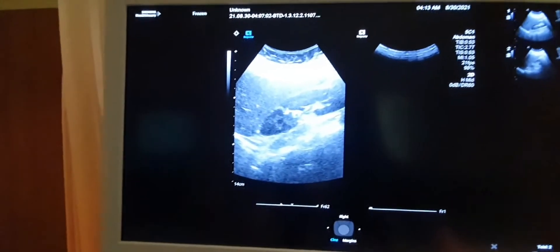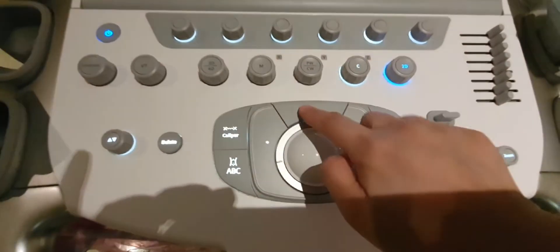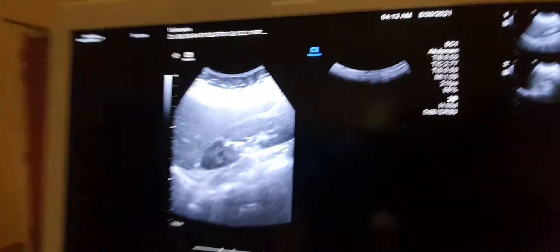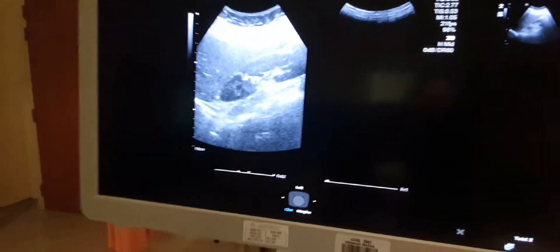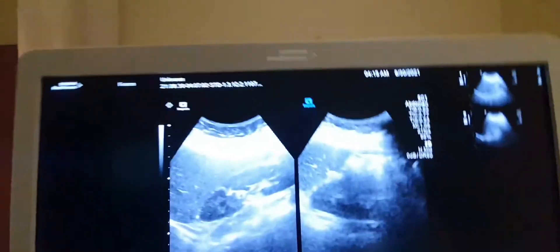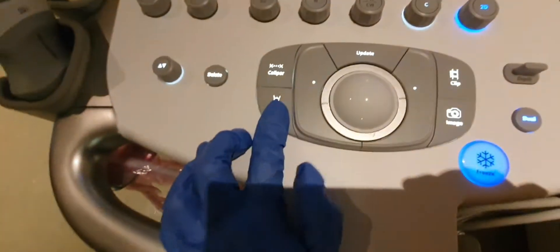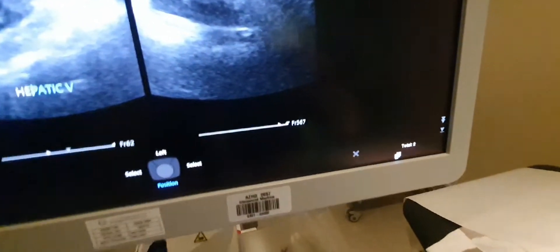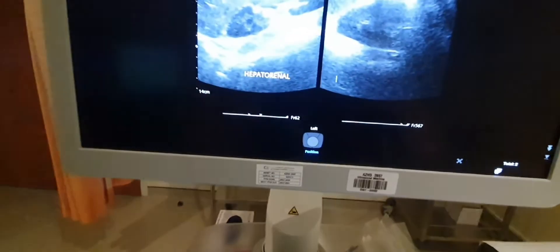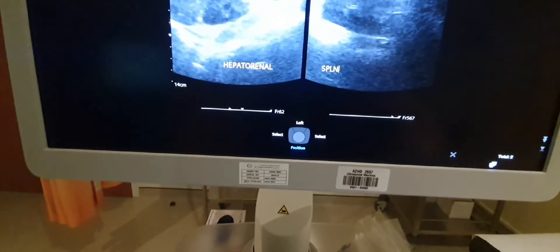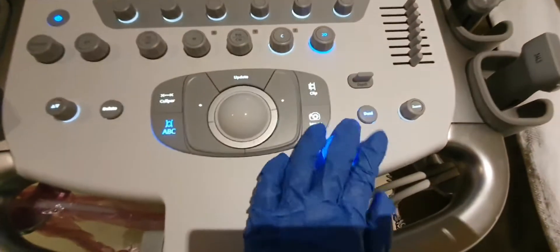Okay, this is the hepatorenal view — the liver and the right kidney together. Then you just press 'Update' so the next image goes to the second box. Apply gel again. I don't have a good image of my spleen and left kidney right now, but that's how it works: you label the first box 'hepatorenal' and the second box 'splenorenal'. That's how the dual button works.